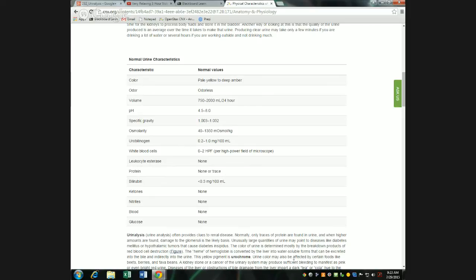Okay, when I'm putting it in, if you give me your sample after I've filled up the first spin, I have plenty of these, so I'll just take yours and put it off to the side for the second spin. There will be a little break while this is spinning. What I'd like you to do while it's spinning is to get the microscopes out, which will not take you as long as a spin takes, but go ahead and get the scope out. And then you'll have some time to kill.